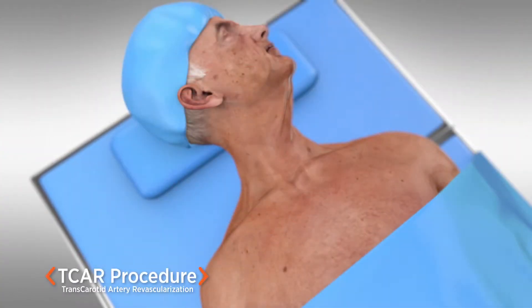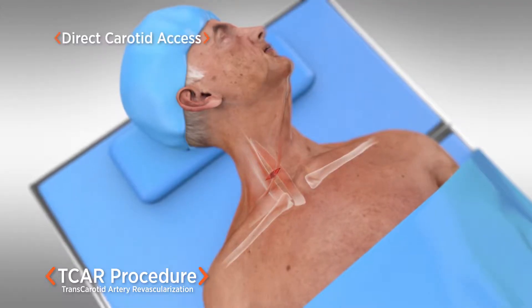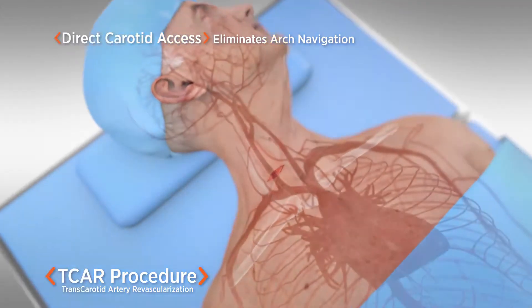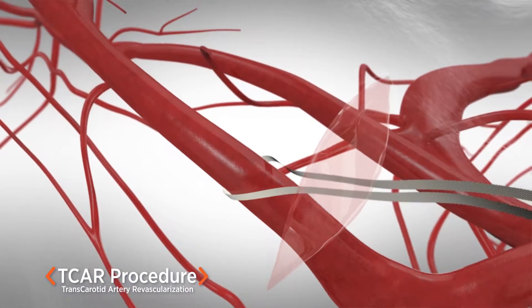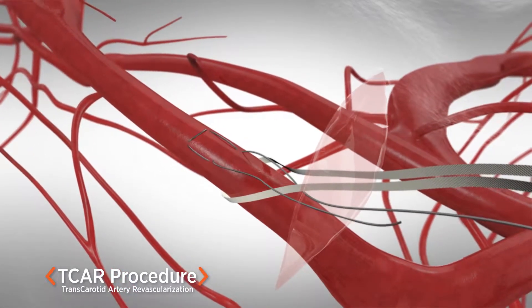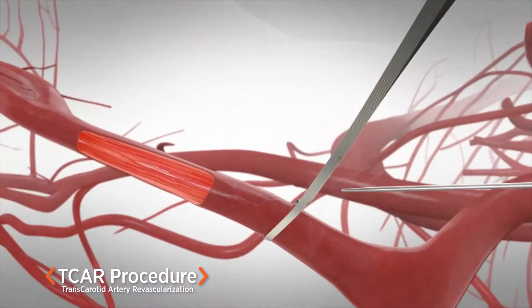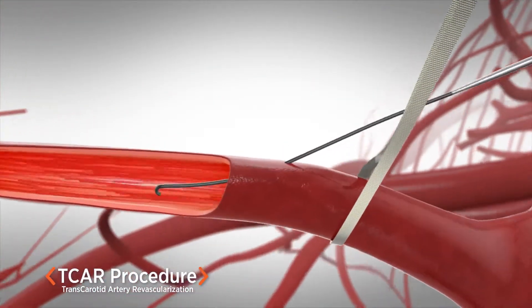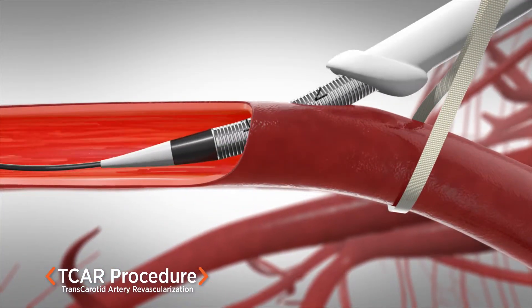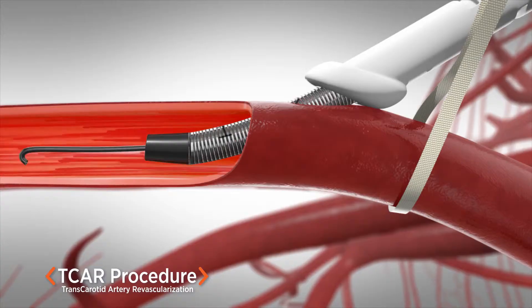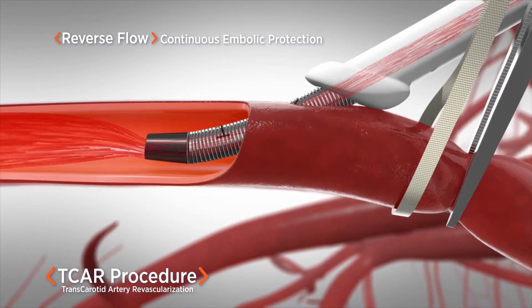The T-CAR procedure begins with a small incision just above the collarbone to expose the carotid artery. A vessel loop is placed to control and clamp the artery during the procedure, and a suture is placed for easy closure of the puncture site at the end of the case. A specialized sheath is placed through a small puncture in the common carotid artery. This sheath will be used to deliver a stent, but first it will temporarily reverse blood flow in the artery.